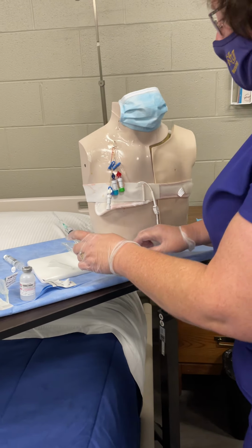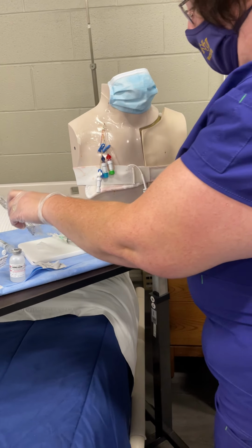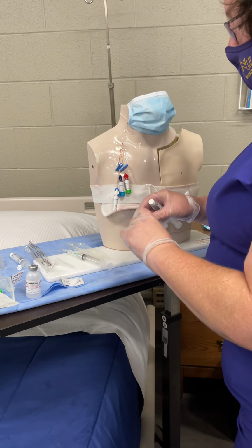Okay, so we're going to bring this into the room. We're going to bring our flush into the room. Introduce yourself, of course, to the patient. Then we're going to give them some medicine through their CVP line.